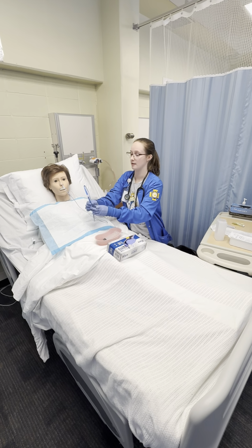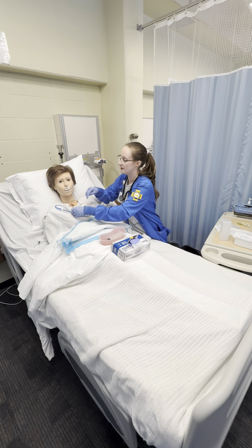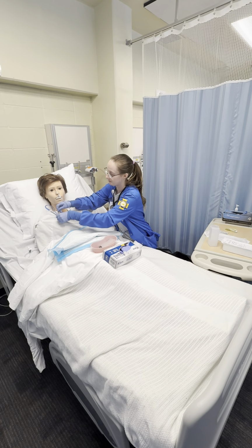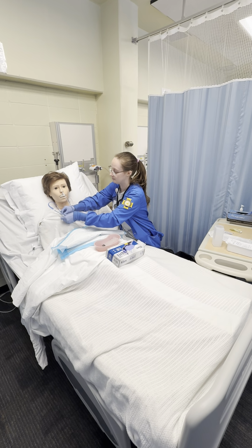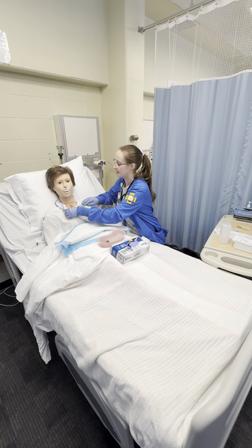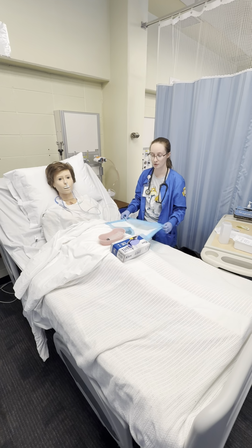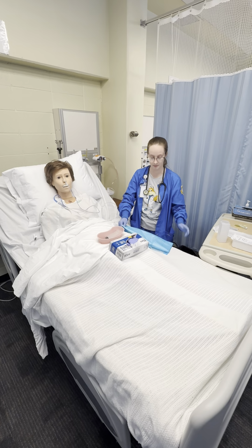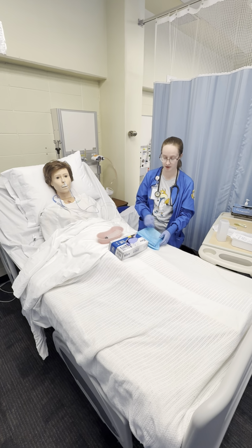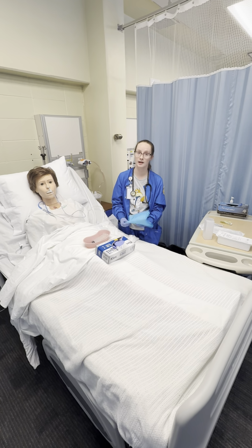So we're going to go ahead and point it upward and secure it to the gown of the patient at the top here. And if we were to have orders to hook it up to a suction machine or a tube machine of some kind, we would want to verify that that machine is working appropriately and is secured and set the way it needs to be set.